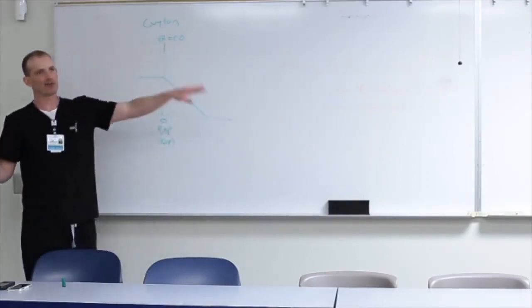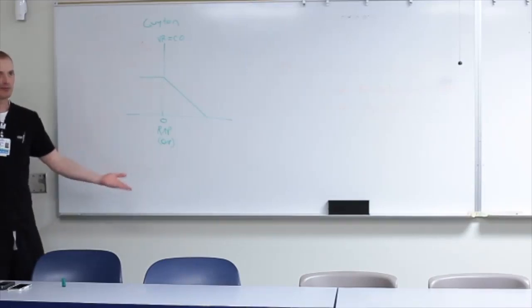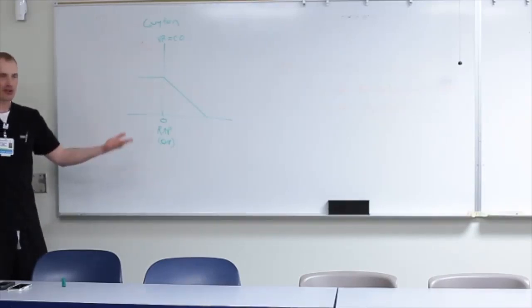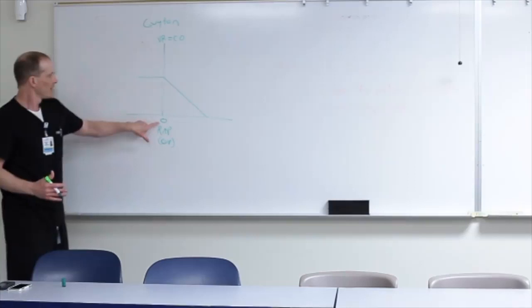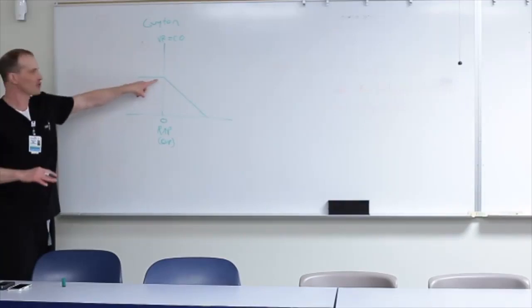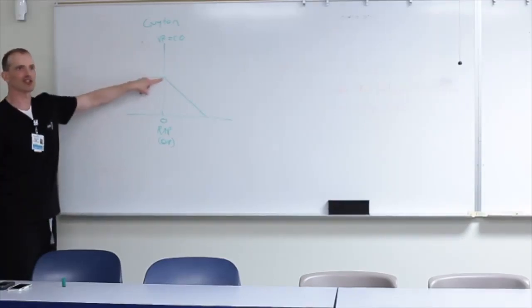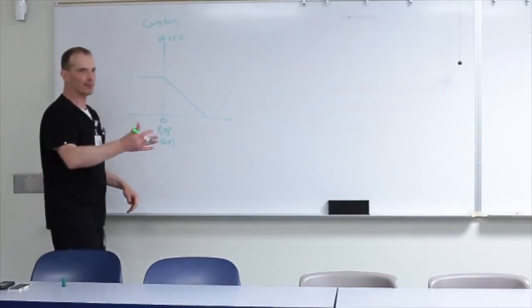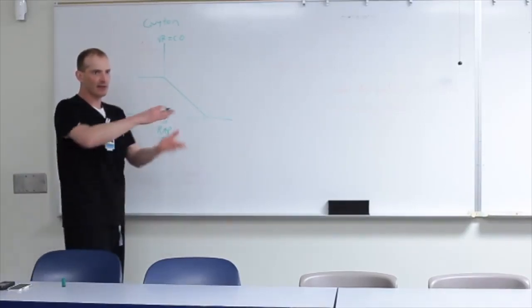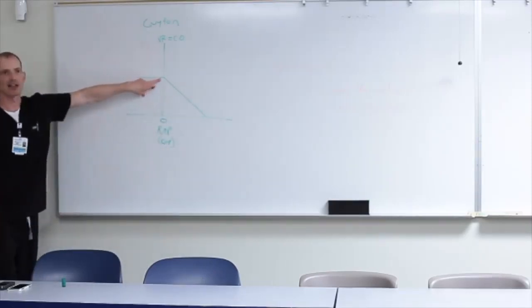But if you go downstream far enough where there's a waterfall, there's suddenly no downstream pressure anymore. So that's the point where the downstream pressure no longer inhibits venous return. And that's why this comes to a limit, because we can't actually start sucking things in when the IVC is already collapsed. This is the point where the IVC is completely collapsed.